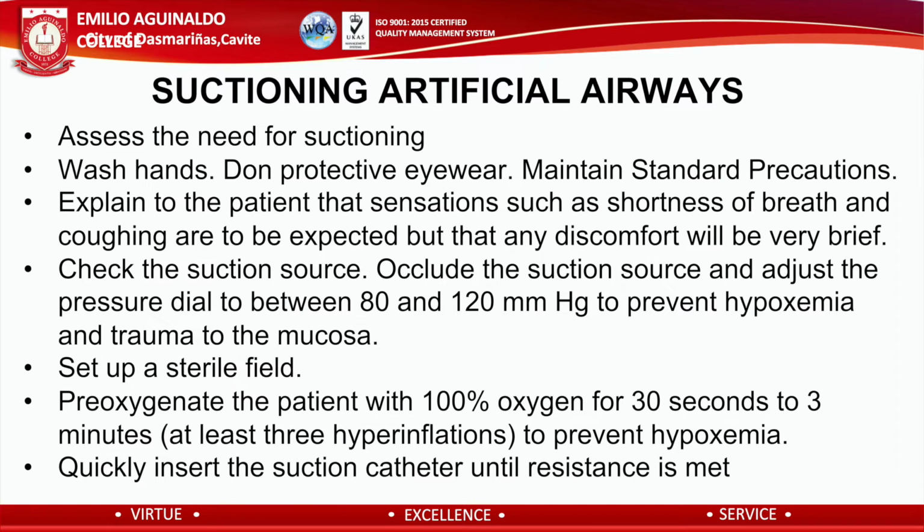Set up sterile field. Infection is possible because each catheter pass introduces bacteria into the trachea. In the hospital, use sterile technique for suctioning and for all suctioning equipment like suction catheters, gloves, saline, or water. Suction the mouth or nose after suctioning the artificial airway. Clean technique is used at home because the number of virulent organisms in the home environment is lower than in the hospital.